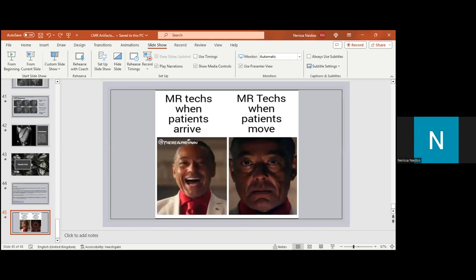Thank you very much. I see the next question says here, in the absence of MR-compatible ECG, can we use normal electrodes? So I would strongly advise against that. I haven't personally used them, and I'm not sure if they would work, because your electrodes generally are very vendor specific, depending on what ECG monitoring system you are using. But besides that, the most important factor is that you could induce RF burns, and I would strongly advise against it.